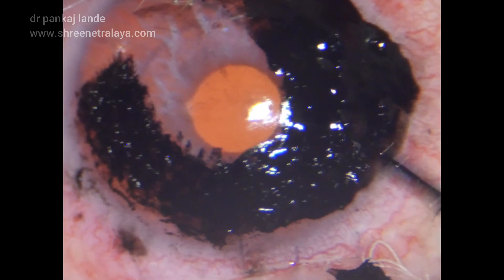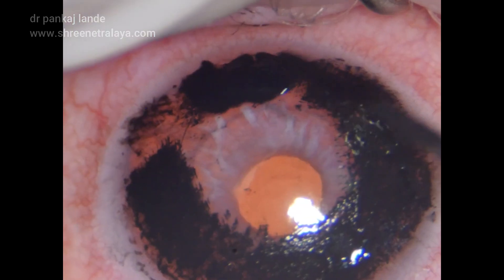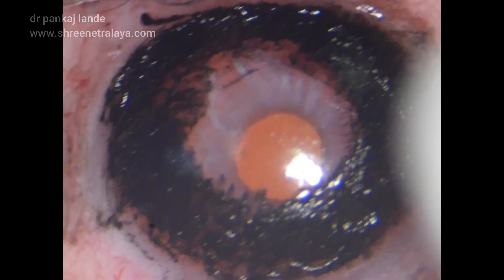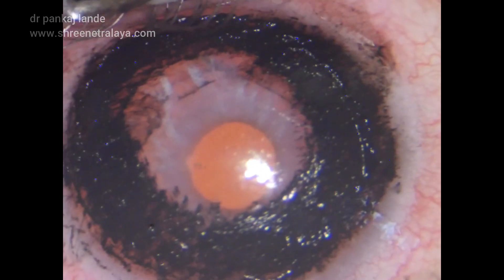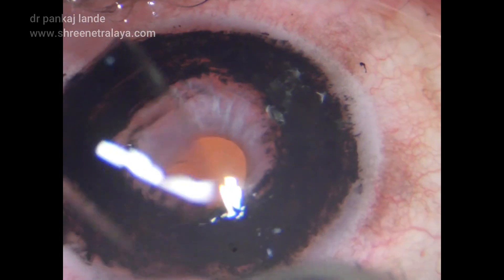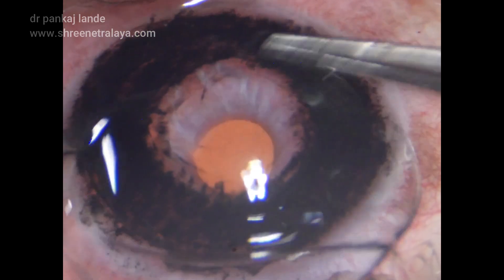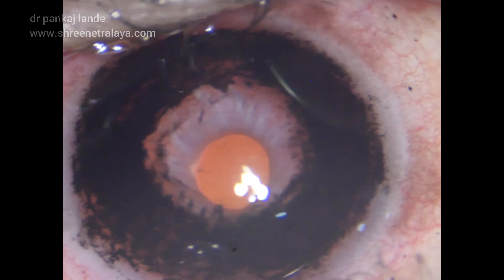This procedure is followed by a patient testimony and the patient is very happy with her present vision. She is planning the same procedure to be done in the other eye, but before proceeding we need to complete her intraocular procedures like cataract surgery, and explain the risks involved — especially the change in color of eyes and irreversibility of the procedure. Once tattooing is completed, a bandage contact lens is applied, which can be removed after 3–5 days once the epithelium has sealed.